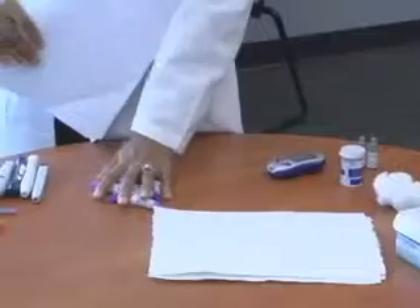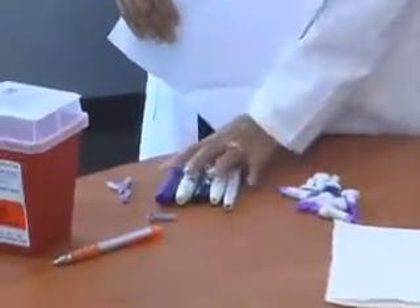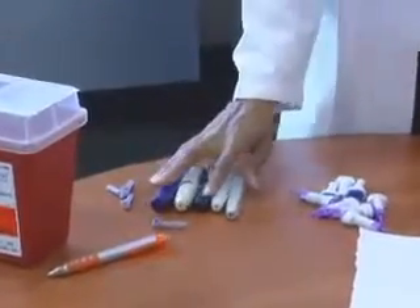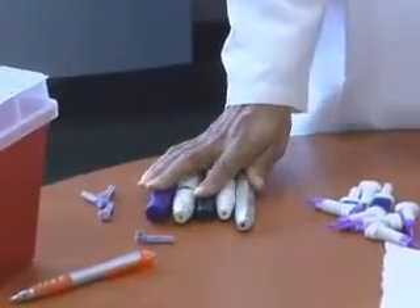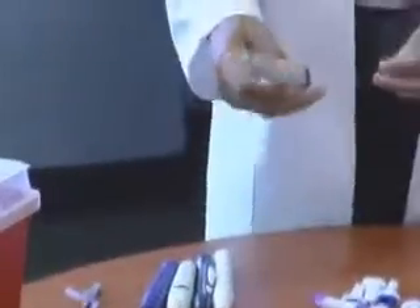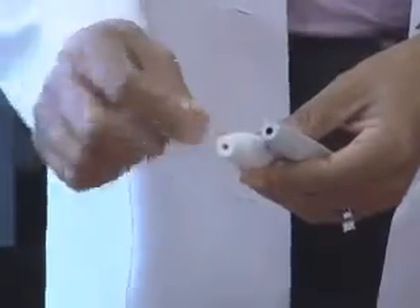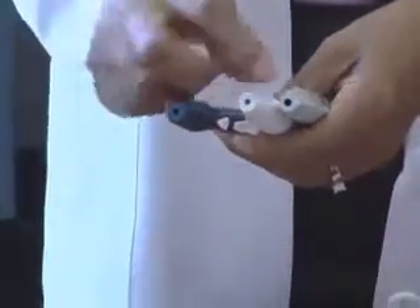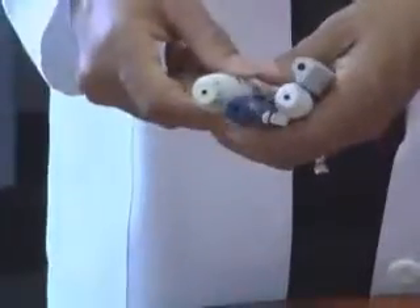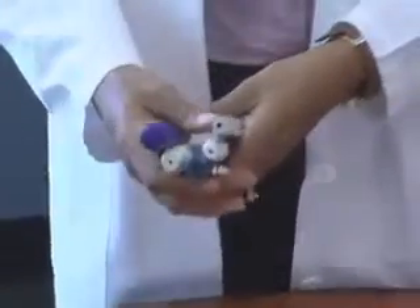You'll want to have disposable lancets and not these types of lancet devices. These lancet devices are meant to only be used on one patient. You never want to use the type of lancet devices that you sell to your patients to do blood glucose screening, because blood can get down into the bottom or the tips of these devices and you could potentially infect another patient and expose them to bodily fluids. So you never ever use these types of lancet devices to do diabetes screenings.